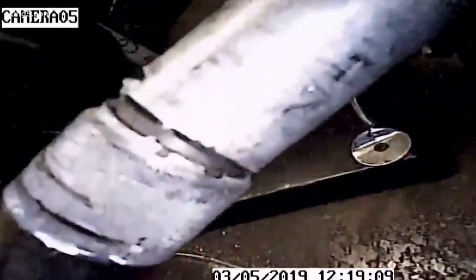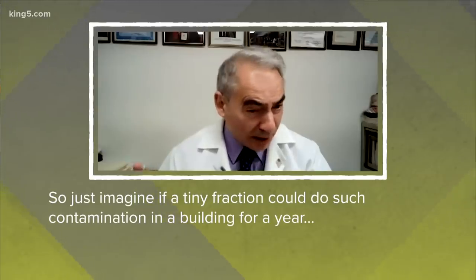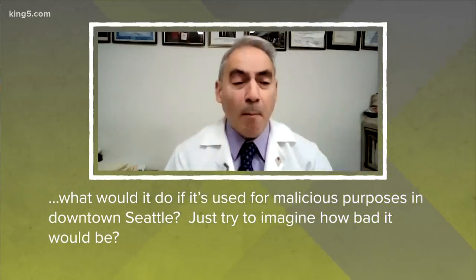This video shows the cuts that the contractor intended for the threads on the holding rod, but instead sliced into the sealed cesium capsule. The snow or bright spots that appear on the video is radiation interfering with the video signal. The contractor is unaware that this is the first evidence of a radiation leak. You say that the Seattle accident involved a very small amount of cesium. Yes. But what does this accident tell us about how dangerous this stuff is? So just imagine if a tiny fraction would do such a contamination in a building for a year. What would it do if it's used for malicious purposes in downtown Seattle? Just try to imagine how bad would it be.